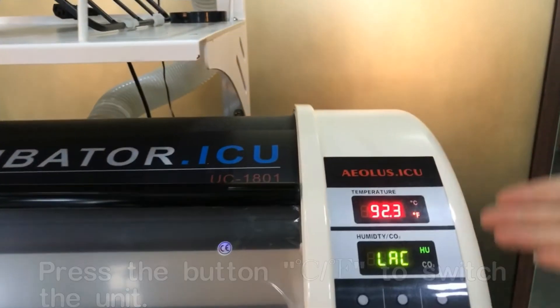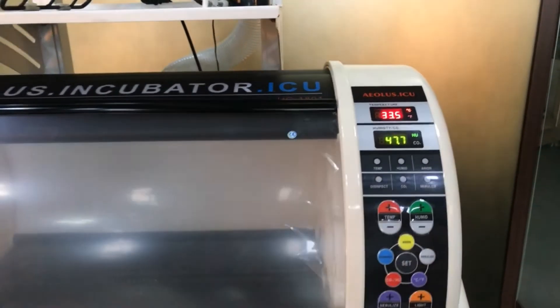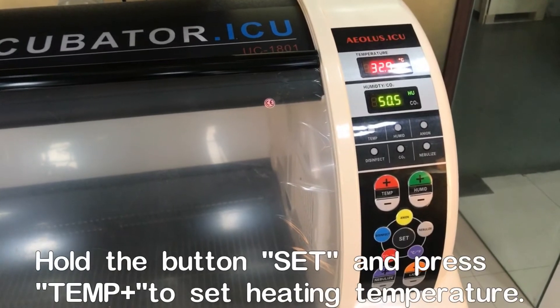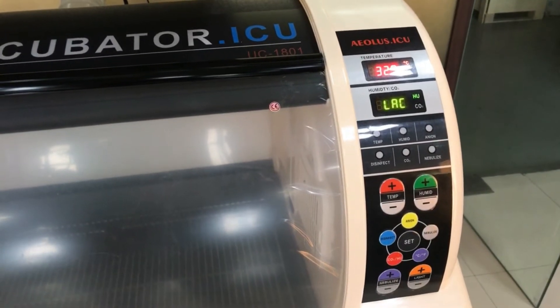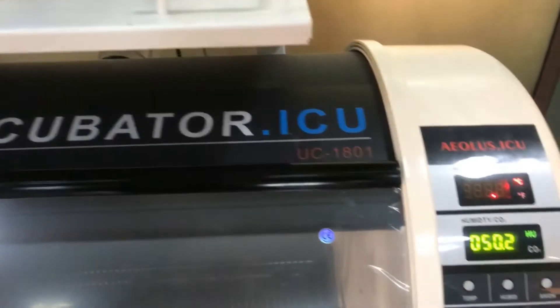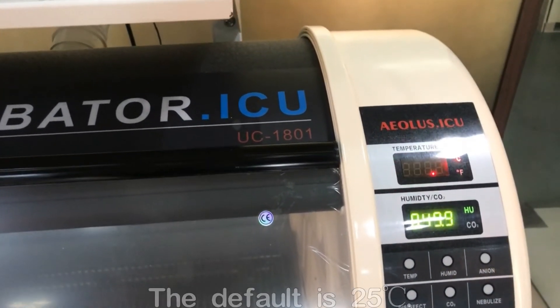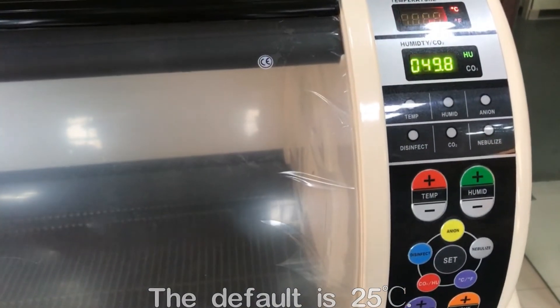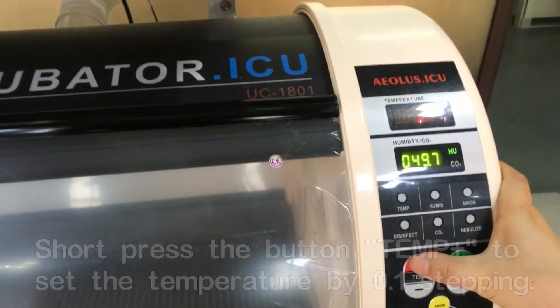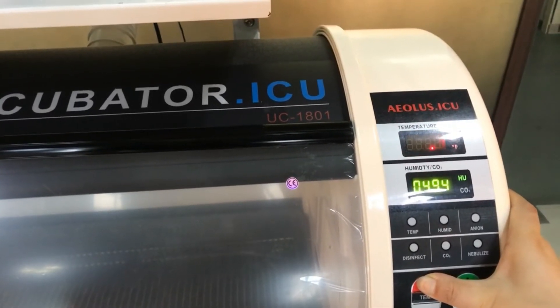When we want to set the temperature, we need to hold the SET button and press the temperature plus button to enter the setting mode. Now you see the numbers blinking. The setting is at 25 Celsius degrees. Hold the plus button — the stepping is 0.1 degrees for each press. Hold it for a longer time and the stepping will be one degree each time.